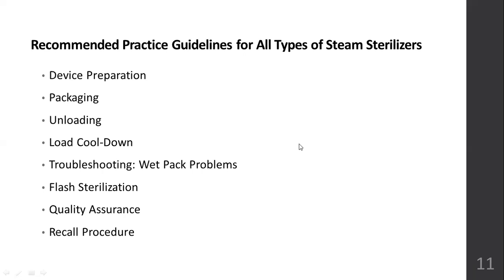Autoclaved articles and hot air oven articles can be kept. They have a shelf life. But after flash sterilization, articles cannot be stored. Within 30 minutes, you have to use the sterilized article.